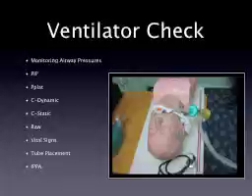Okay, so what do I do on a ventilator check? Well, there are a lot of things I monitor, obviously, with the placement of the tube, the cuff pressure, my IPPA assessment. I'm also going to assess the peak inspiratory pressure. It's under monitoring airway pressures, and then I'm going to assess the plateau pressure. If I'm in pressure control ventilation, the plateau pressure is irrelevant. I won't be able to assess it, but in volume control, definitely assess the PIP and the P-plat. And of course, from that and the PEEP, you can also do a static and dynamic compliance. It's a compliance dynamic and compliance static, the C static and C dynamic calculations.